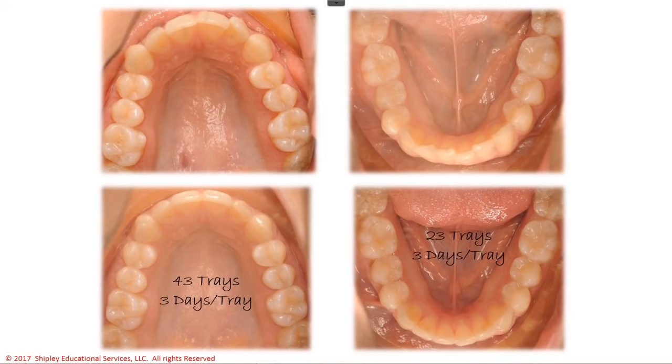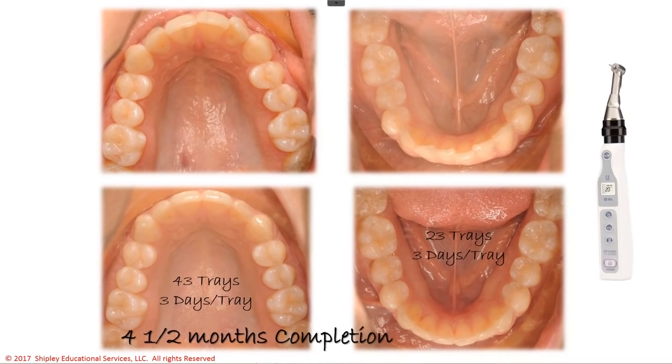Through the research that I had read and through mostly my own clinical experience that I'm now trying to document with research, I feel very comfortable with doing Propel MOPs and changing the aligners every 3 days. In fact, recently one of the residents in West Virginia just finished a thesis project which I think has some interesting data in it about Propel MOPs, and hopefully we'll have that ready for publication before too long. It's something that I feel strongly about, I believe in. I think clinically, in my mind, there's no question that this works, and I want to be as much of a leader as I can in trying to get the clinical data and research out there. With the Propel MOPs and Propel driver, we can really speed up these cases, especially in our Invisalign cases. Tonight's almost entirely going to focus on Invisalign, but we can use the Propel MOPs with braces also.